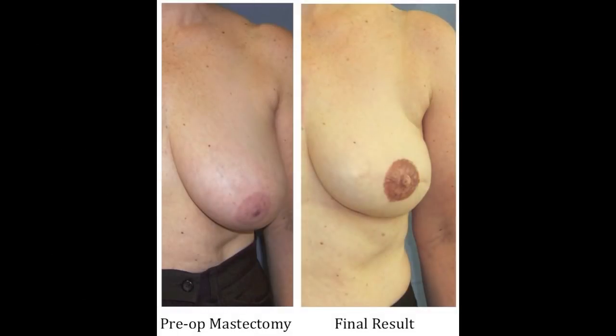Once nipple areola reconstruction is complete, the result from the preoperative on the left to the postoperative on the right is excellent.